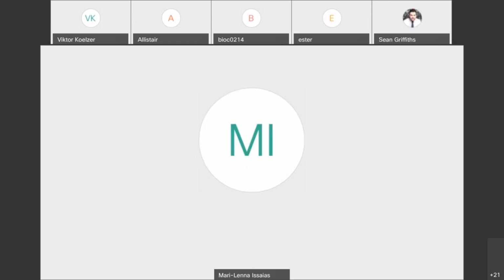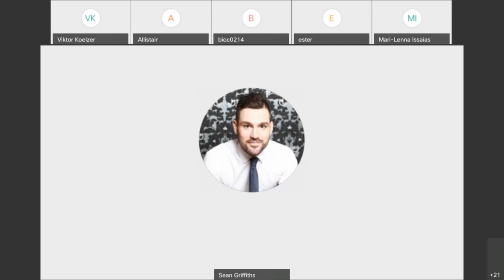Okay. Well, thanks a lot for attending then, everyone. I'm again very pleased to see everyone online today. It's really encouraging. So thank you for your attendance. We're really pleased to be able to show some of the new modules, especially the AI stuff, which has come a long way. So we're here at your disposal, and please have a play with the system, utilize it. You've already incorporated it into your institution, so please use the existing asset you have, and we're here to help should you need any further explanation.